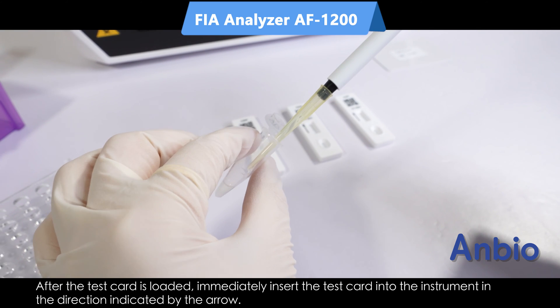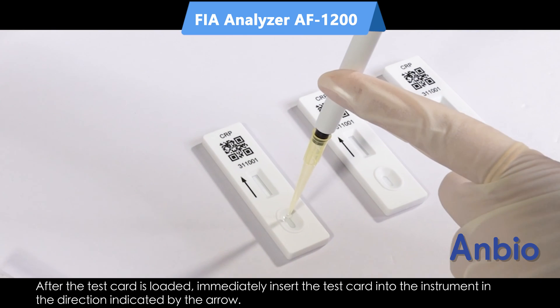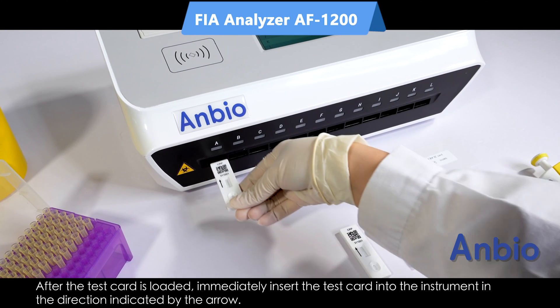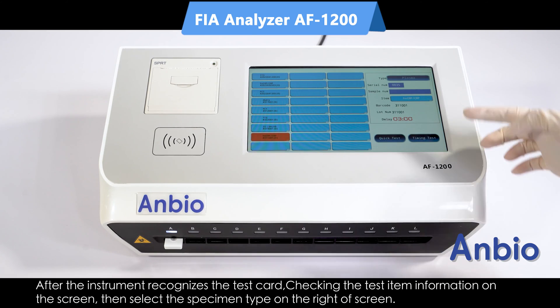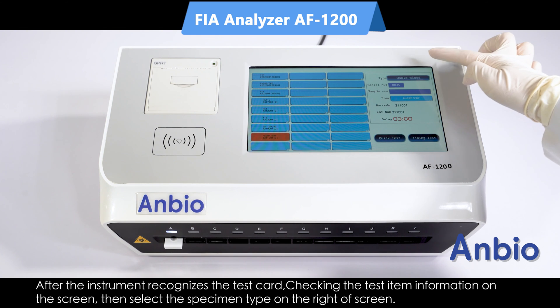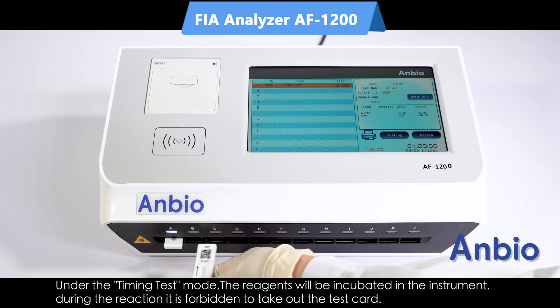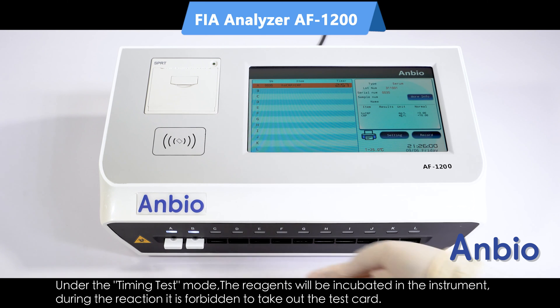For timing test mode, after the test card is loaded, immediately insert the test card into the instrument in the direction indicated by the arrow. Check the test item information and select the specimen type. Click timing test on the screen, then the system will start counting down.